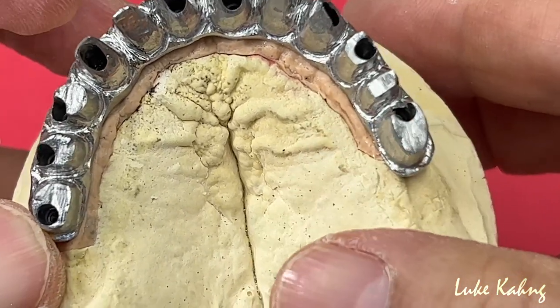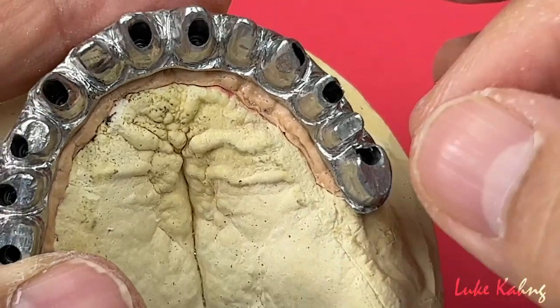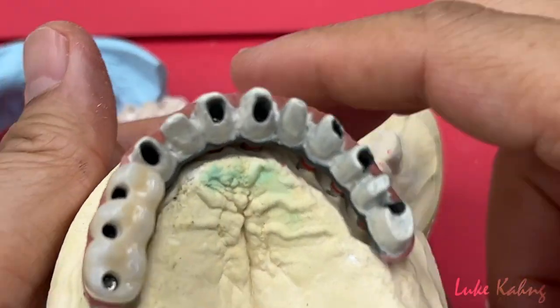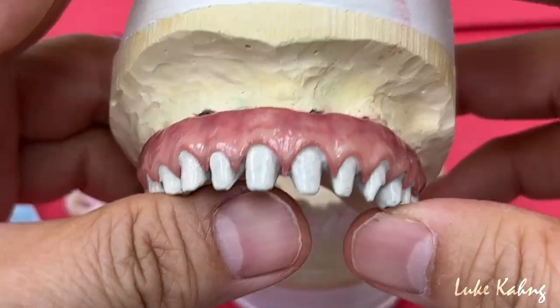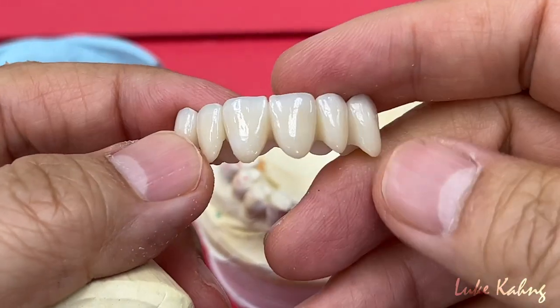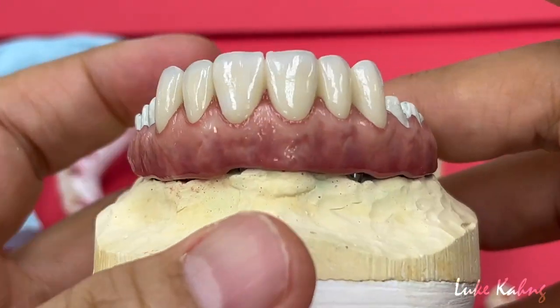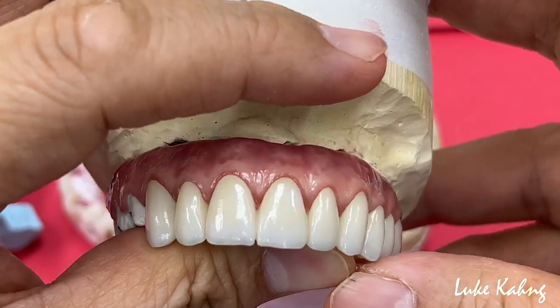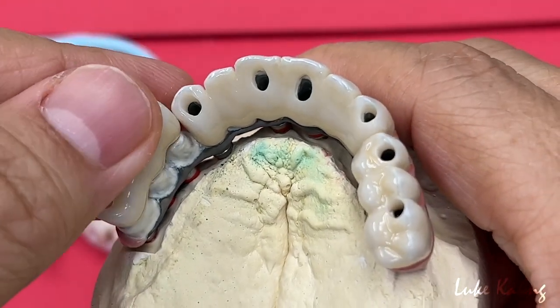The margin line here cannot be opaquer or porcelain, so we decided to polish it with metal. We have a 3-unit bridge, trying to make 6-unit, and also another 3-unit bridge, trying to get rid of the undercut. In many cases we made two pieces but we're going to cement together.